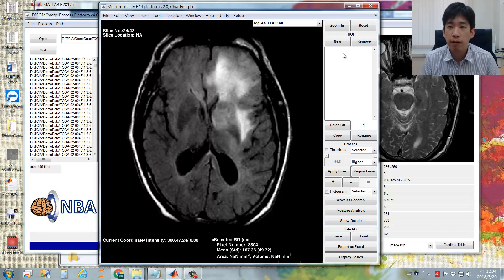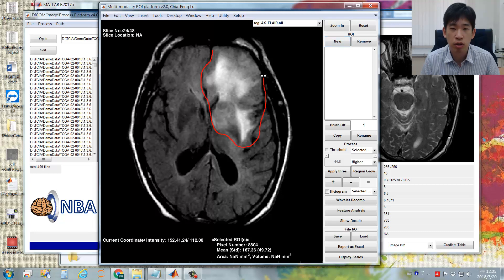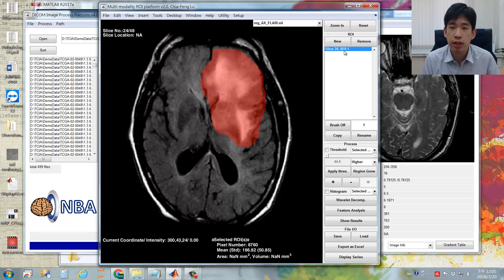In the ROI panel, you can simply click the New button. Your mouse will become a cross pattern, and you can draw an ROI by freehand. Once you release your left button, you will see a new ROI created. The ROI region is labeled as a transparent red region.